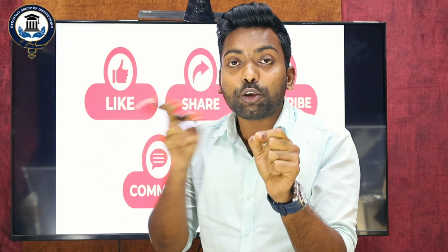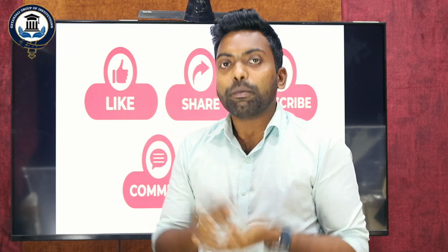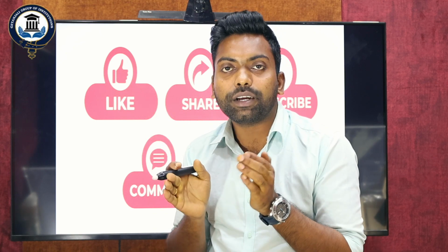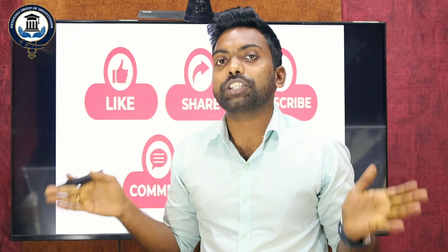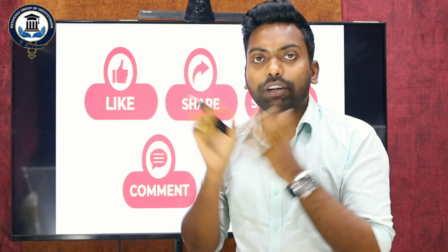In that case, you are the medical person, you must check the blood pressure very carefully. By this video, I hope all the students understood how to assess and feel the pulsation of the blood, how to feel by auscultation, what the differentiation is, and how we need to check. Yes, this is what I discussed for this session.